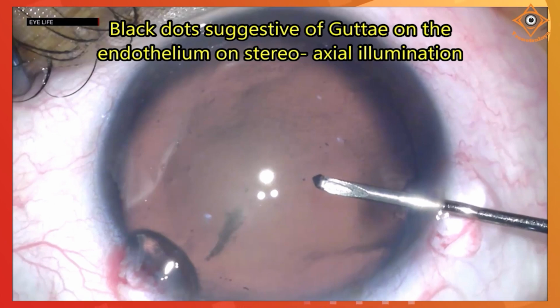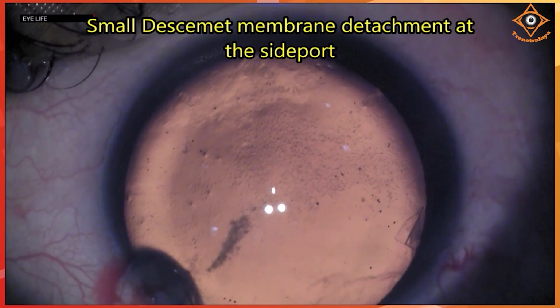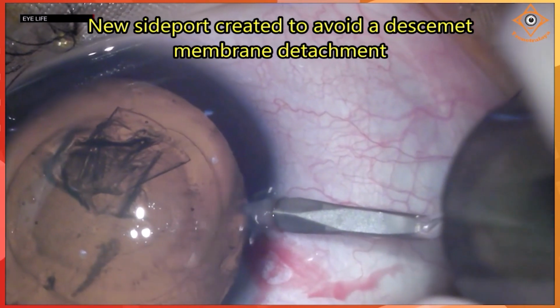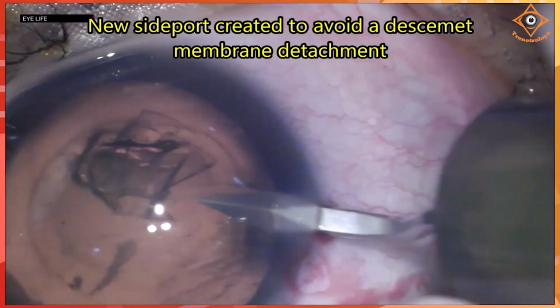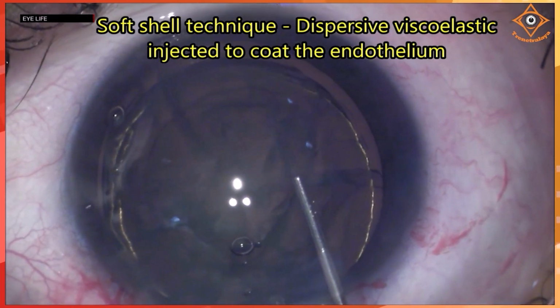As you can see here on the retroillumination, the black dots on the cornea are very suggestive of guttae. Now I have caused a small Descemet membrane detachment at the side port, so I've created a new side port. That is the safest thing to do.